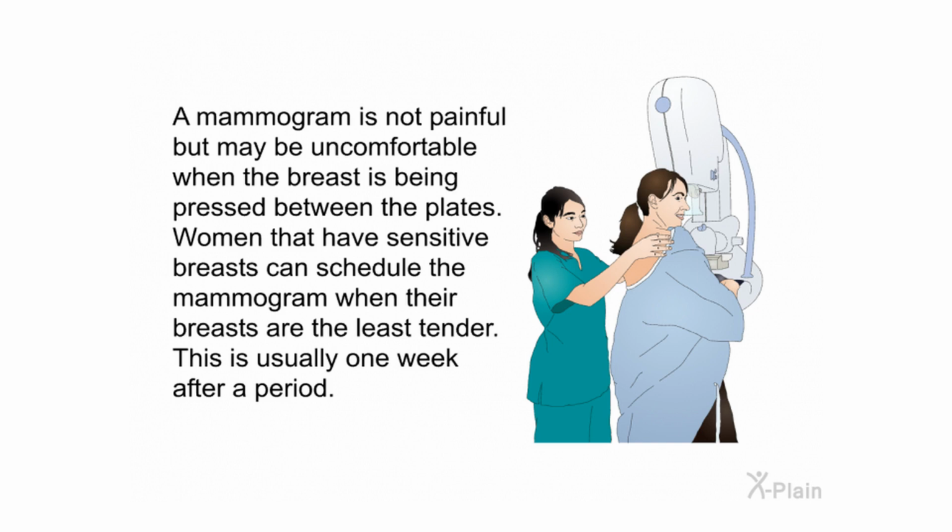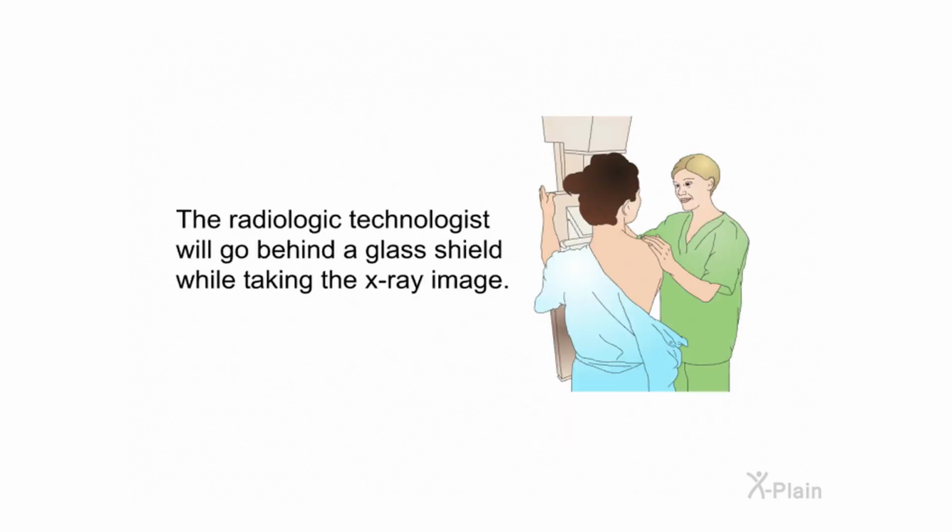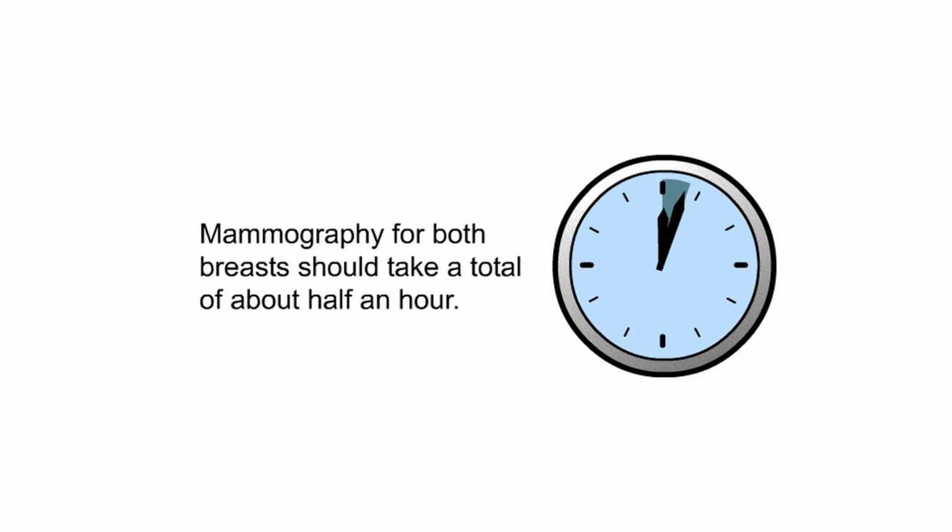A mammogram is not painful, but may be uncomfortable when the breast is being pressed between the plates. Women that have sensitive breasts can schedule the mammogram when their breasts are the least tender. This is usually 1 week after a period. The radiologic technologist will go behind a glass shield while taking the X-ray image. Mammography for both breasts should take a total of about half an hour.